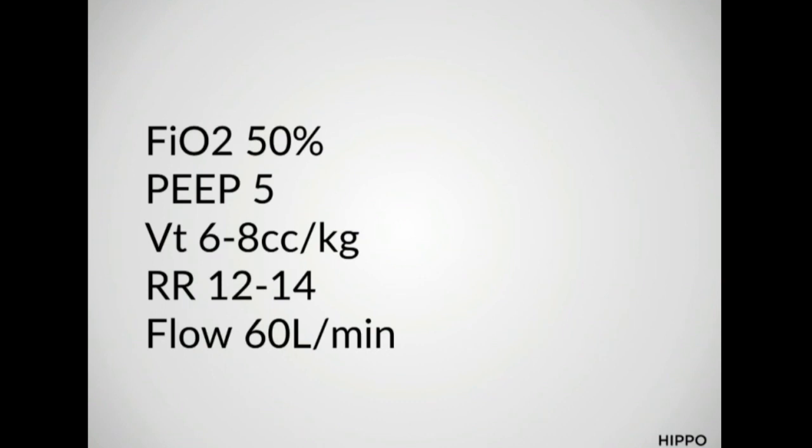Does that make a huge difference? Because it seems to me like if I'm going to be increasing my flow, then I'm just going to be getting that volume faster. Right. And it depends which mode you've started them with, but often starting around 60 is reasonable, and we usually titrate this in increments of 10.